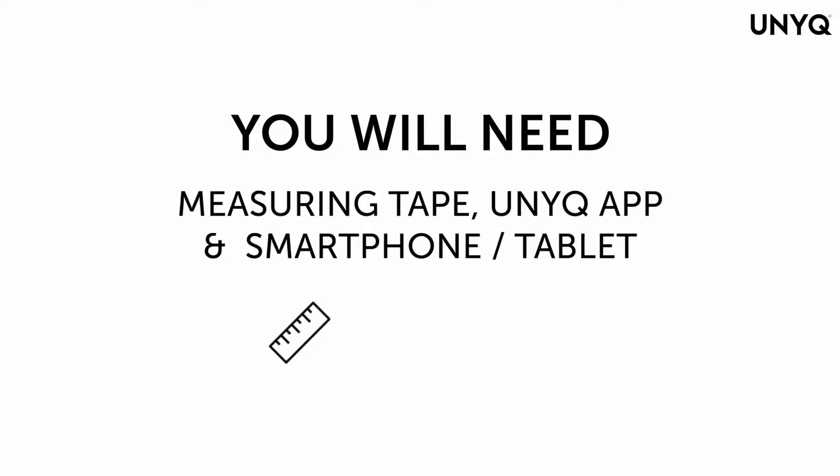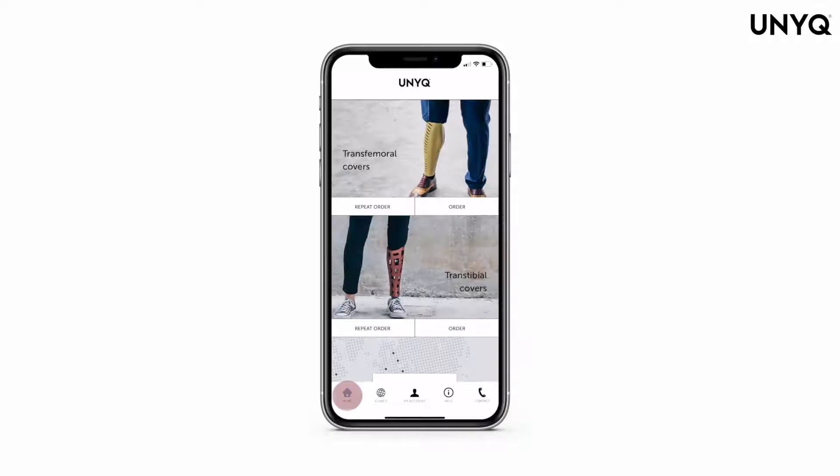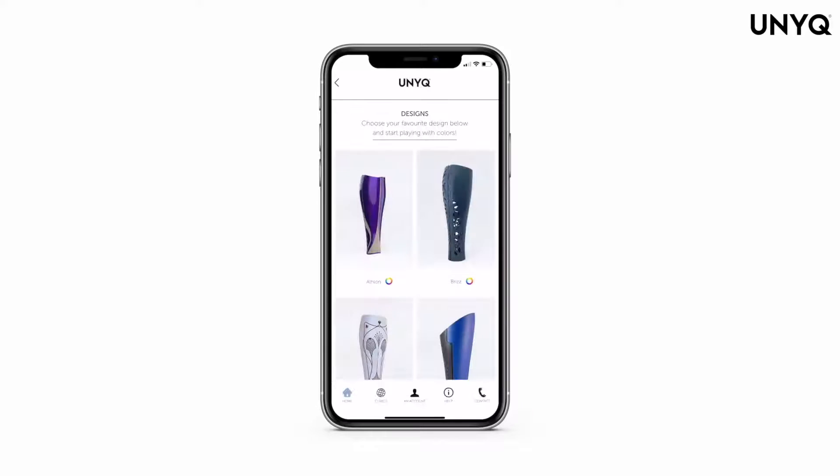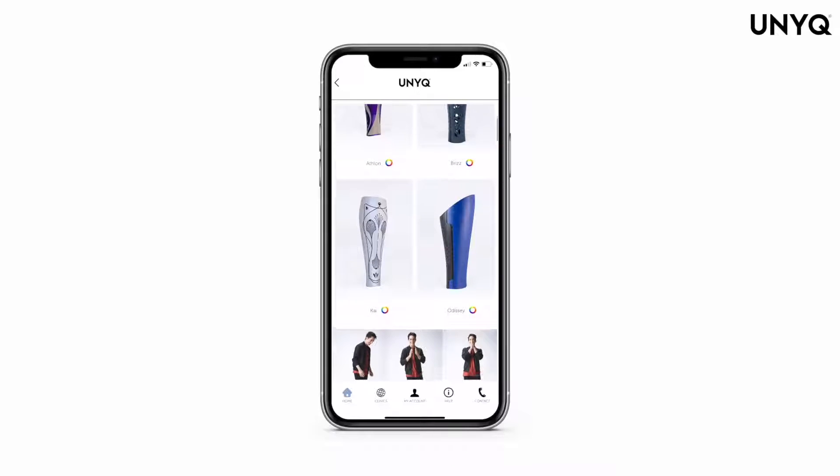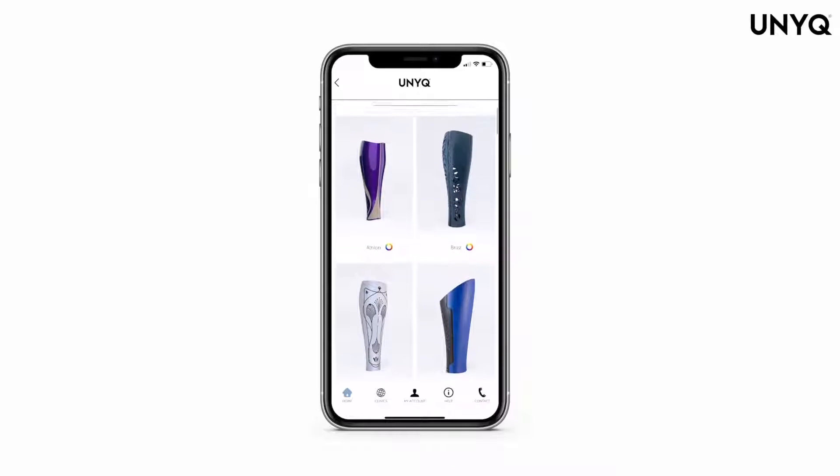You will need a measuring tape, the Unique app, and a smartphone or tablet. Select the home button and press order. Help the patient choose a design from our catalog.